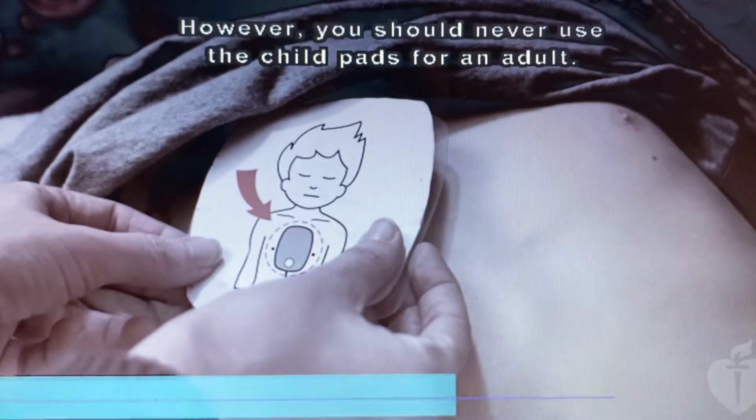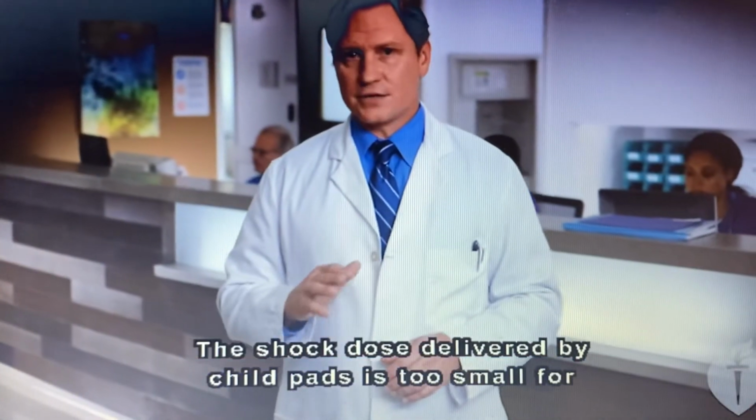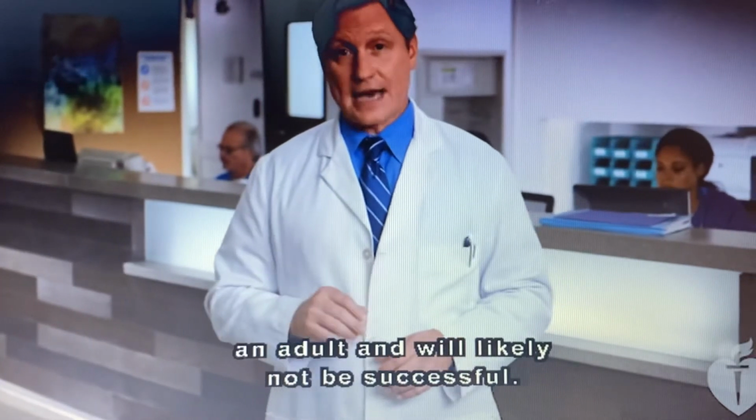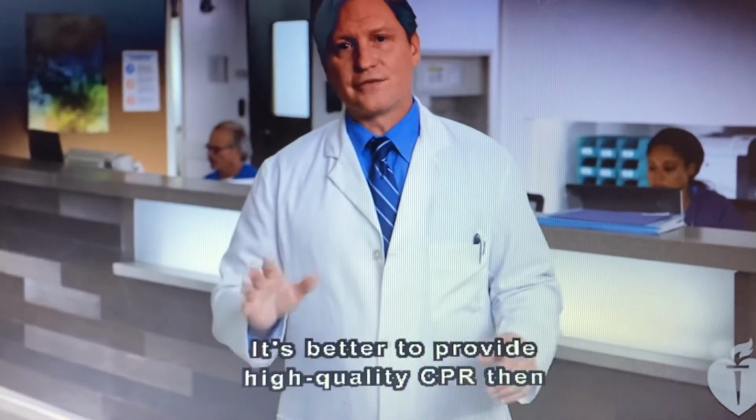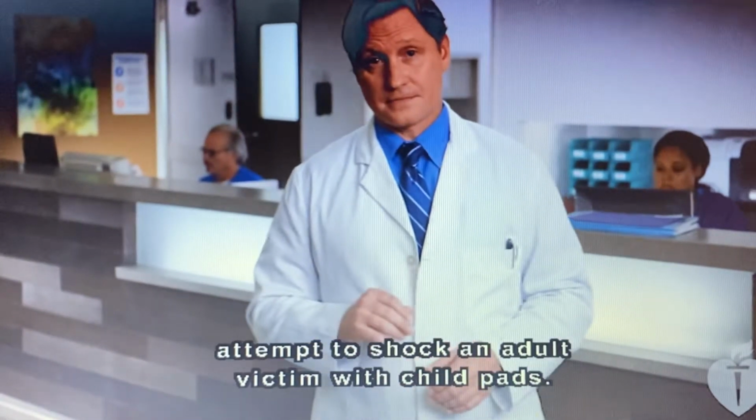However, you should never use the child pads for an adult. The shock dose delivered by child pads is too small for an adult and will likely not be successful. It's better to provide high-quality CPR than attempt to shock an adult victim with child pads.